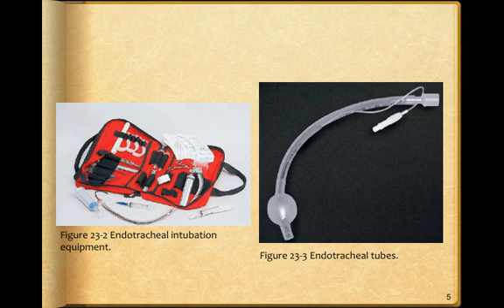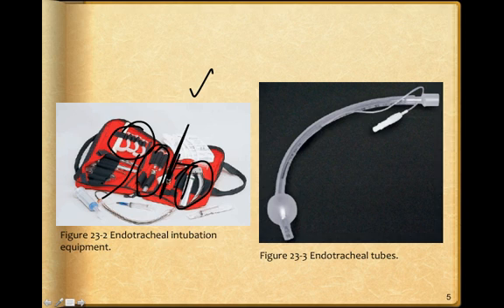So, endotracheal tube intubation equipment should be kept in one location where it's all easy to get to. So, oropharyngeal airways, extra blades, ready to go, Magill forceps, 10 cc syringes, and generally these will have secondary packs on here, or you can just lay them in here like this, of your ET tube. ET tube with stylet. This would be an esophageal detector device, so all of your stuff essentially in one location.